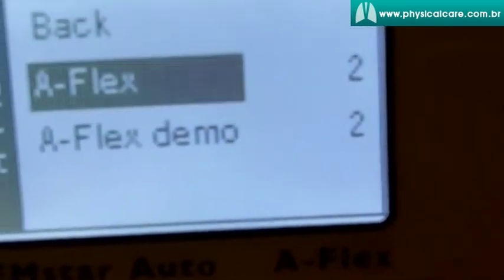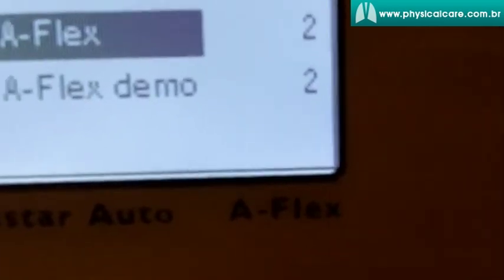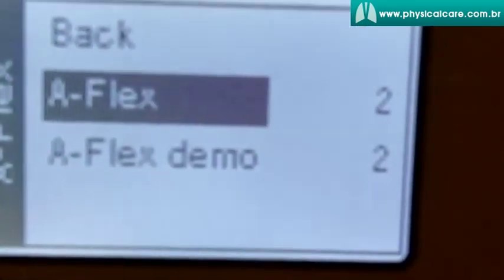The first one is AFlex. If you hit AFlex, this basically allows you to change your AFlex setting. That means it enables you to make it easier for you to exhale and make breathing a lot more natural. So you can change this number, but what I really like is this part here — AFlex Demo.